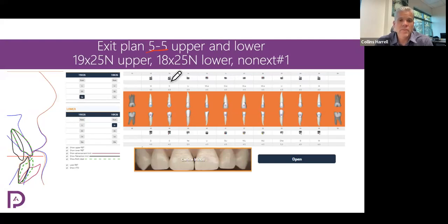What if that front tooth isn't rotating well and you just can't get that front tooth straight? Are you going to be willing to put some brackets on and help that tooth get straight? So if we're having a hard time with the aligners, it's a good idea to have a backup plan, have the patient understand that brackets may be required to finish their case. If they're not wearing their aligners well, or if the teeth aren't responding well to the aligners.